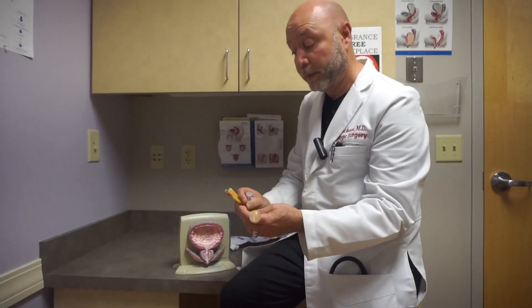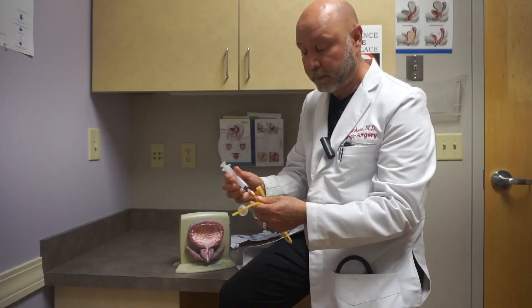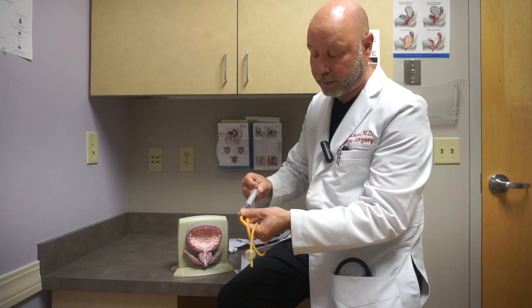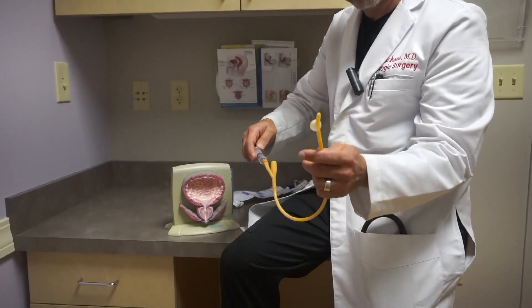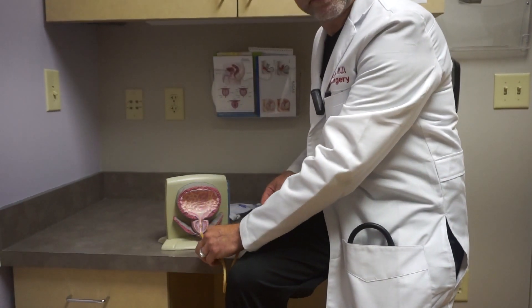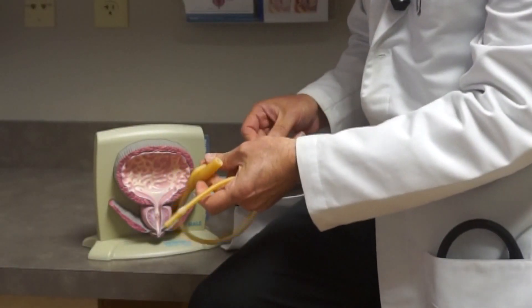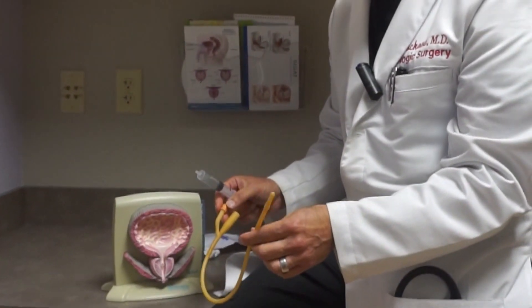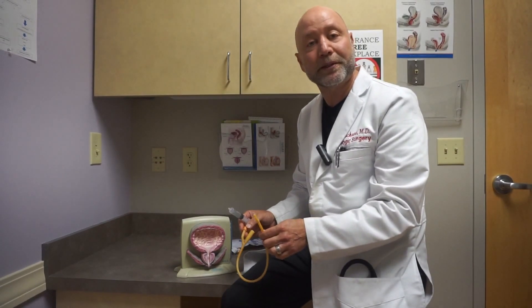Same idea for a man. When we want to remove the catheter, we stick the syringe back into that port, pull the fluid out of the balloon, collapse the balloon, and the catheter can come out. Oftentimes we do this for you, but there are some times that we'll ask you to be able to do it yourself at home. I just wanted to give you a little summary so it makes a little bit more sense.